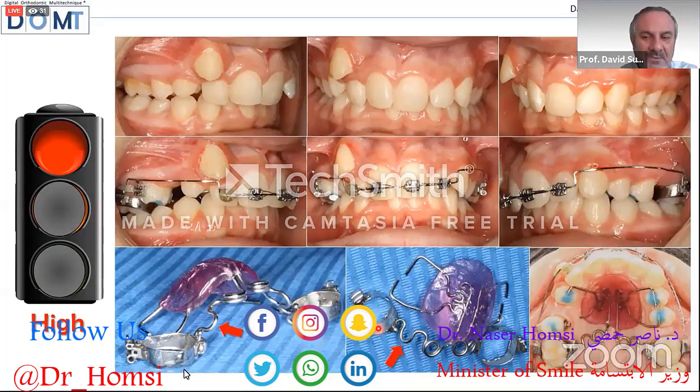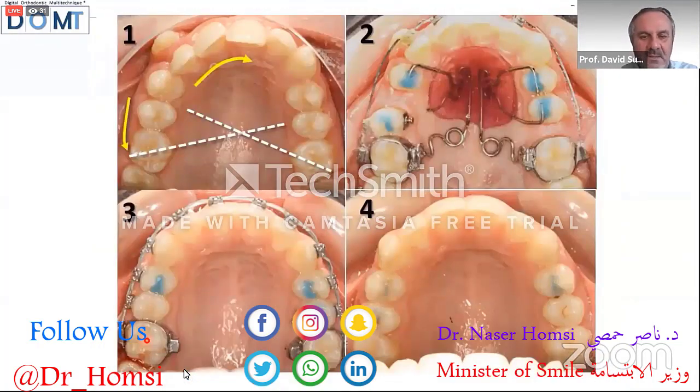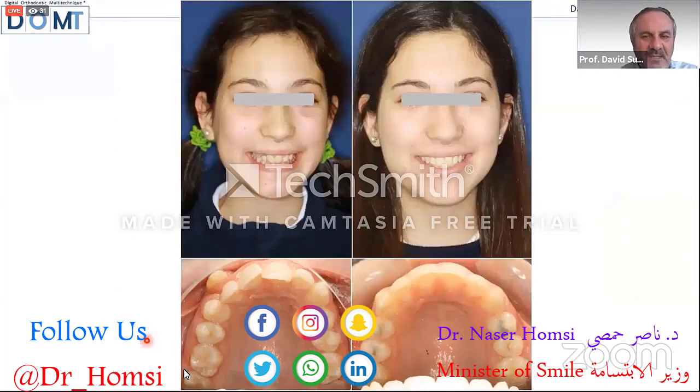Okay, using a pendulum appliance. We use a pendulum appliance, and the first step is to correct the first upper molar. Now we are using intermaxillary elastic to engage the occlusion. Okay, very simple, very important. Now, to move the canine and premolars backward, we are finishing the treatment. And the most important is this.